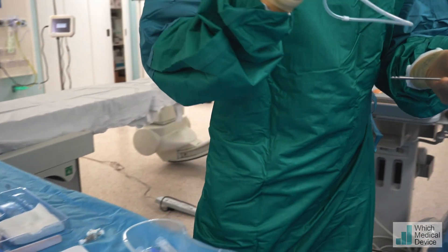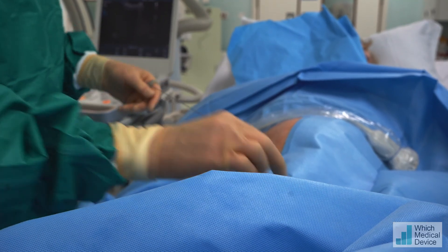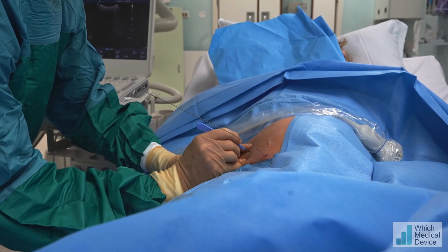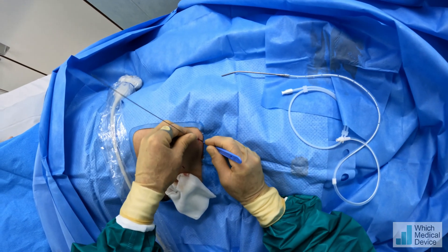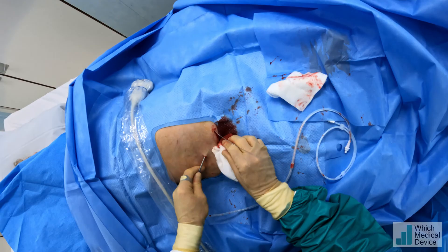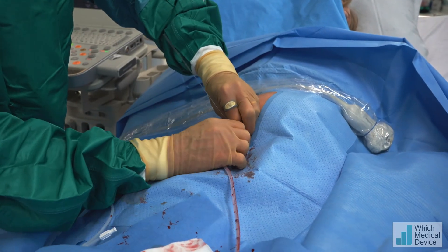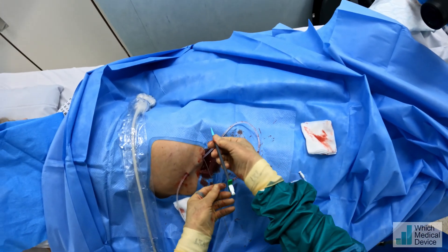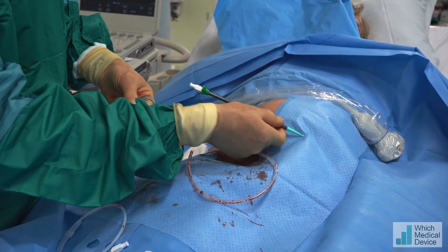I've got my tunneller and I've put a slight bend on it so I can steer it, a bit like I did with the spinal needle. We're going to make a small incision for our exit site — does that feel sharp? So that's going to be our exit site. I'm just going to make that one slightly bigger because we need the peel-away sheath in there as well. We're going to take the tunnel from the outside here all the way along with the tunneller, come out through there, holding the wire so we don't pull it out. We'll take the cuff along about halfway. Then we're going to take the tunneller off and advance the peel-away sheath. This peel-away sheath can go an awful long way, so you've got to be confident about the distance — generally I don't put it all the way in.